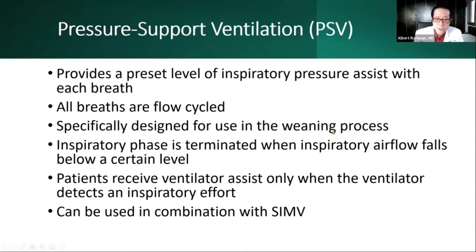Specifically designed for use in the weaning process, the inspiratory phase is terminated when inspiratory airflow falls below a certain level. Usually 25% is the default. The patient receives ventilator assist only when the ventilator detects an inspiratory effort. In pressure support ventilation, if the patient is not breathing, it will not give a breath. It has to be a spontaneous effort.